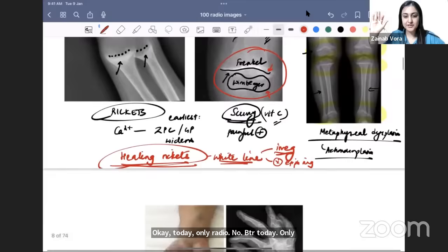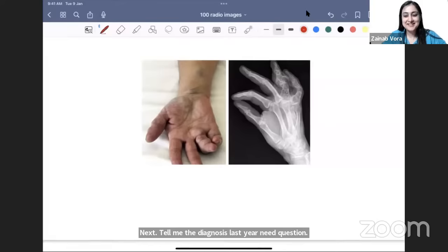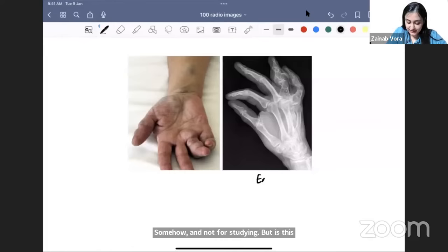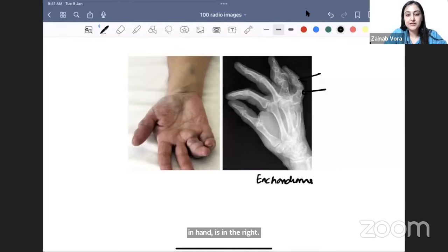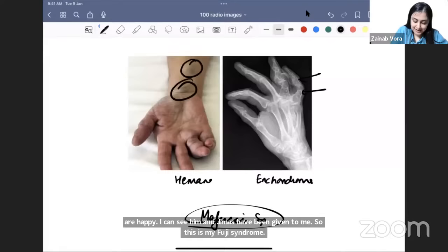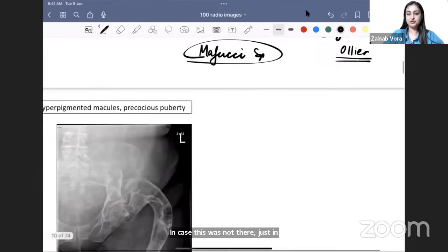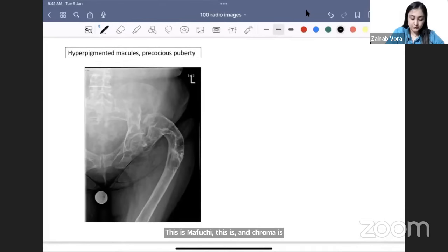Next: hand tumor — seeing multiple tumors of the short tubular bones of the hand points to enchondroma. But here there is a syndrome: hemangiomas have also been given, so this is Maffucci syndrome — enchondroma plus hemangiomas. If only enchondroma without hemangiomas, it's Ollier's disease.